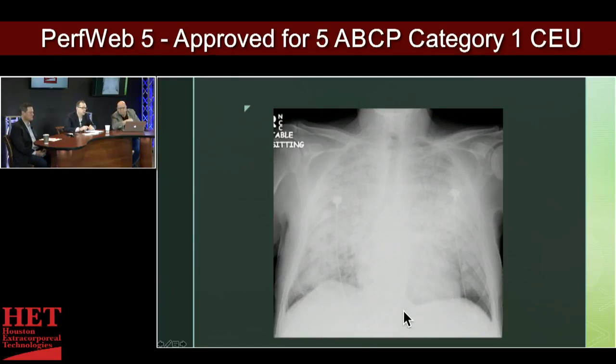It can be. So what causes a wide mediastinum or an enlarged heart? Dissection, yes. You could have a large pericardial effusion. You could have just cardiomegaly from long-standing CHF. If they dilate the ventricle, over time the pericardium will accommodate. You could have a bleeding issue from a dissection, a perforation, a rupture, things along those lines.